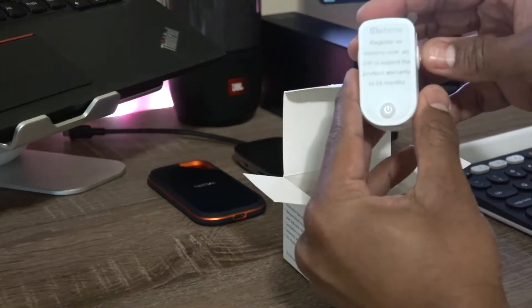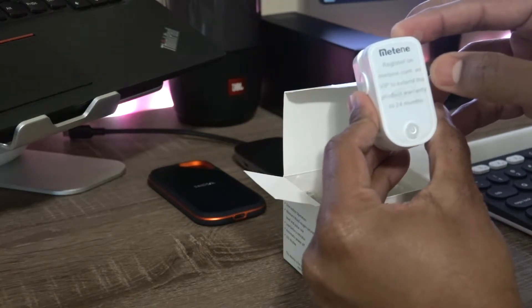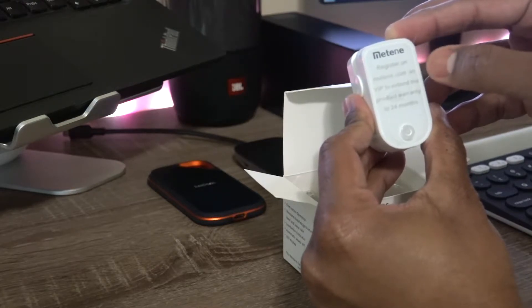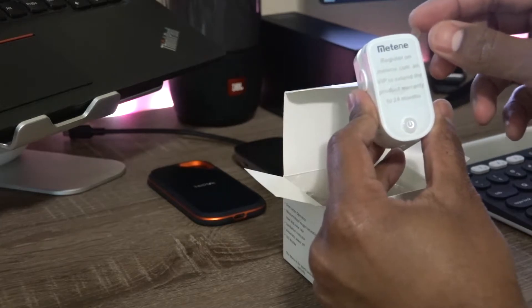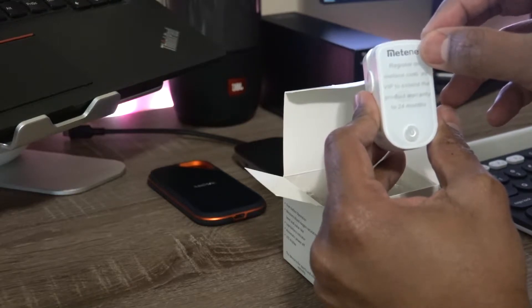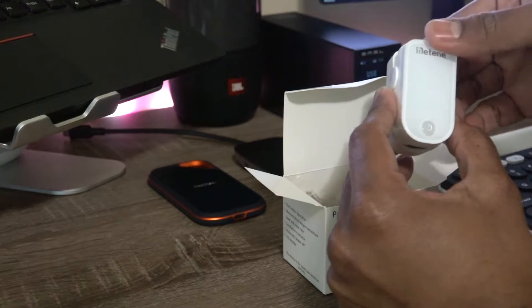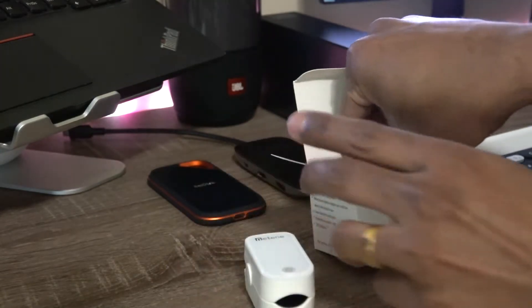So this is the oximeter — it's pretty neat, it's white, and it doesn't show the display evidently. It has a display inbuilt behind that white screen. On the top they say if you want to extend your warranty for 24 months you can register it on metene.com. And this is the product.